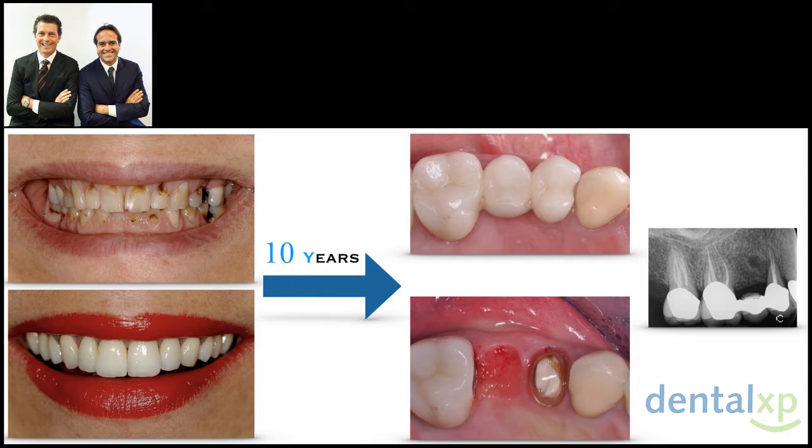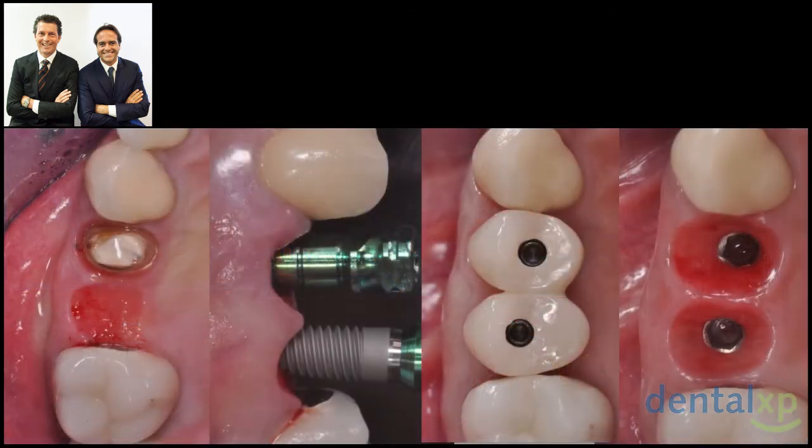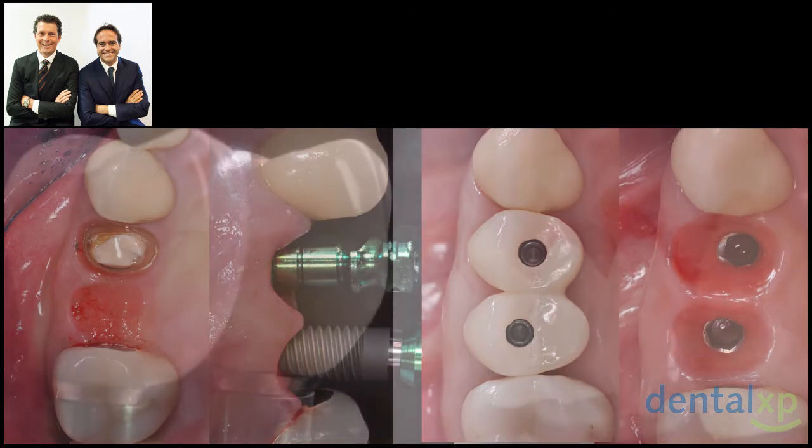We should define also the clinical scenario we are in, and it's a type 1, and actually it's a type 1 in number 14, which is an ideal situation because we have a thick buccal plate, we have a thick gingival biotype, and we are mainly in the posterior region. So let's see how this was treated. You see extraction the same day, and on the same day an implant was placed in a fresh extraction socket and a flapless implant in the healed region number 15. Of course, provisional restoration was the key in order to maintain that soft tissue around those implants.